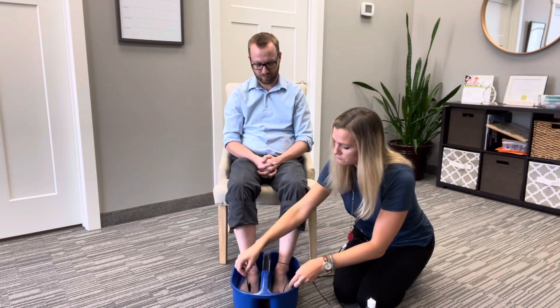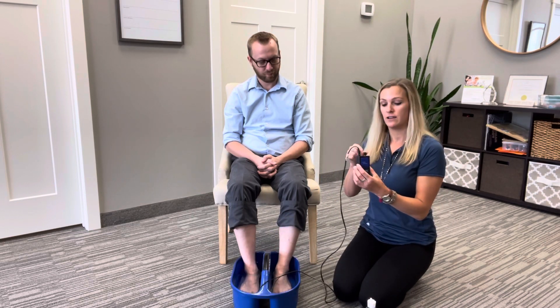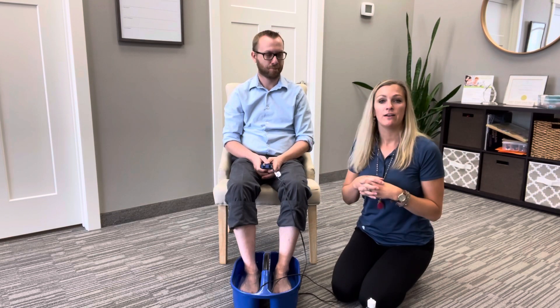Then we put the pads in there. The patient would turn it on and turn it up to their comfort level. It does not hurt at all. It will also shut off after a half hour so you know your treatment is done. While you're doing this treatment, you can be sitting, watching TV, reading a book. For the peripheral neuropathy of your hands, the gloves can be done while you're even sleeping, and the unit will shut off on its own.